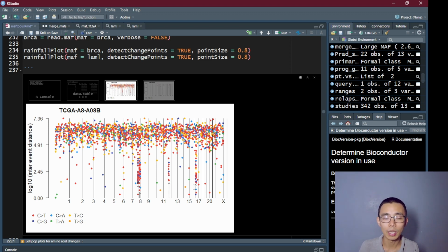So this kind of mutation hotspot could be a cause or a correlate of the cancer, depending on your situation. But breast cancer has significantly shown this pattern, which has been detected in breast cancer again and again. And if you do have mutations in these three sections of the gene, I suppose you should get checked on whether your breast is having cancer or not.